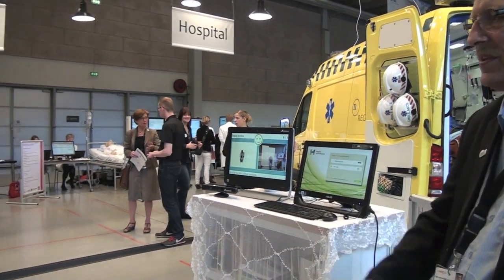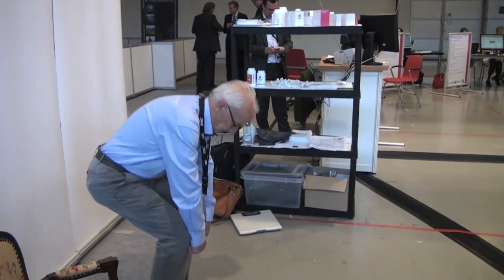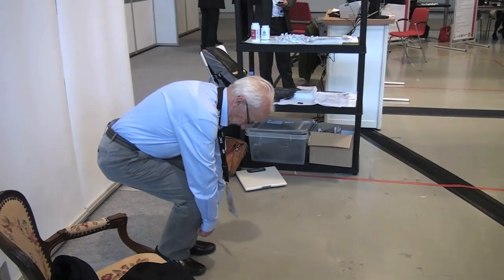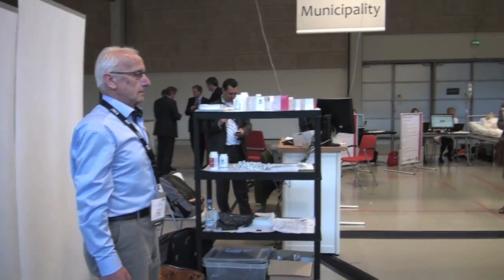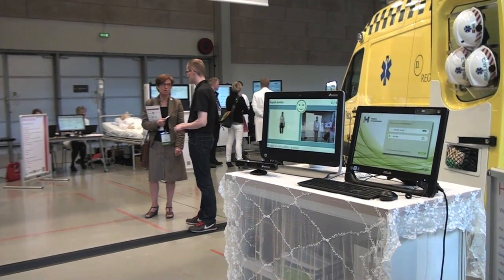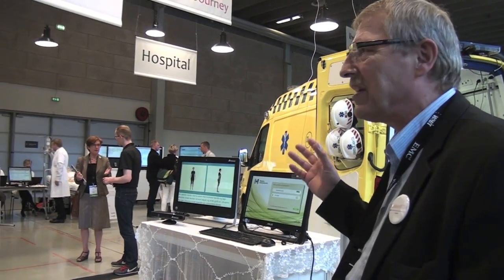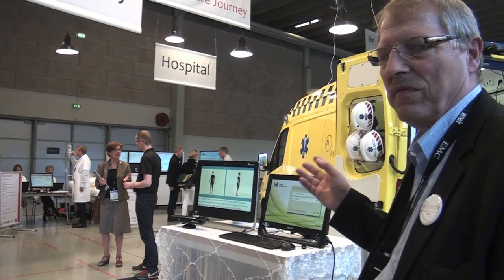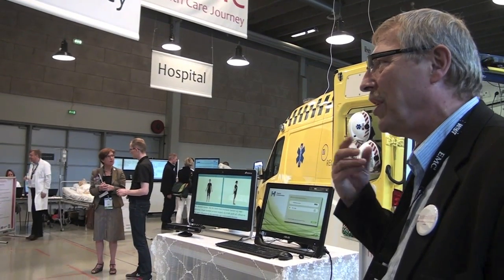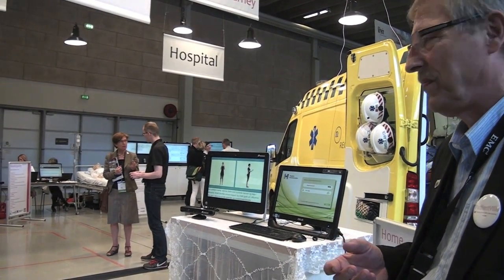So now the patient is doing as instructed by the computer program. You can see he's going to do it 5 times as is written on the screen. And when he's finished, his effort will be evaluated by the computer program. If needed, the physiotherapist can establish a video conferencing with the patient in order to correct or in order to alter the exercises if needed.